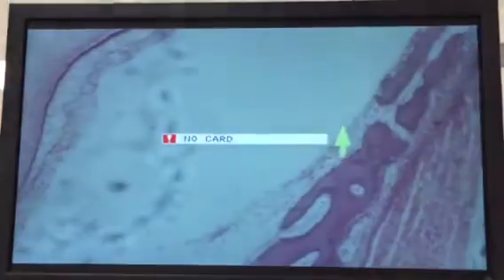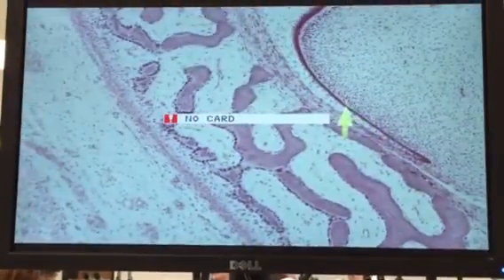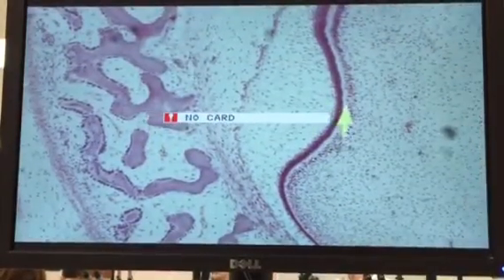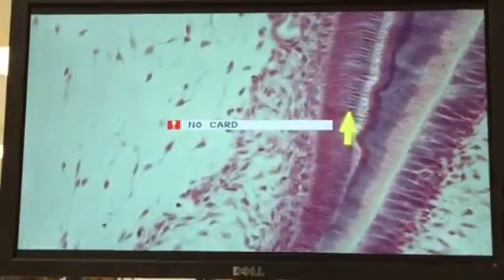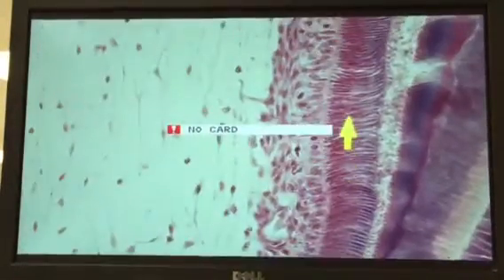If we go to slide 10, things are going to be a little bit further along. And right here, well, we can pick out cervical loop right there. So we have morphogenic stage. Then you can see those cells are getting taller. We have some odontoblasts coming along, so we have the organizing stage. And we begin to find a little bit of enamel being formed, and we can see Tomes processes. So we have the synthetic stage.